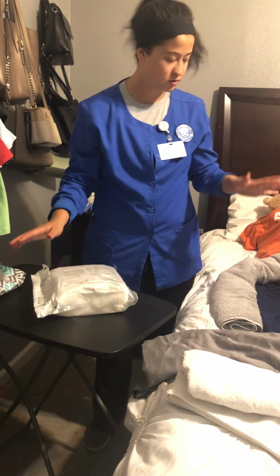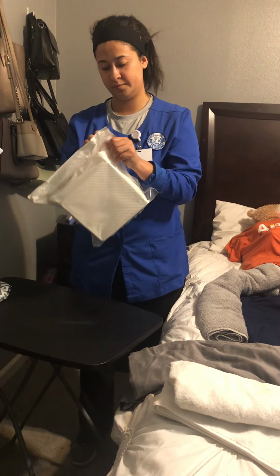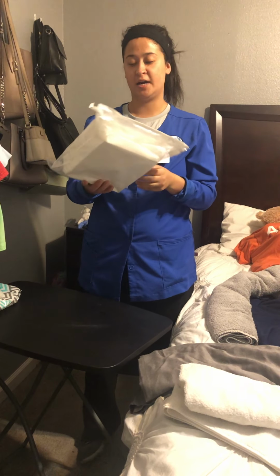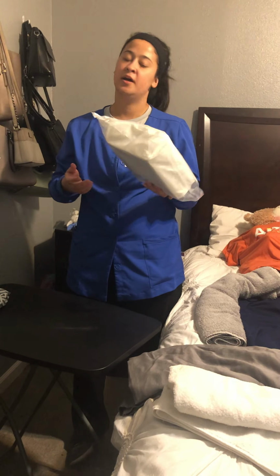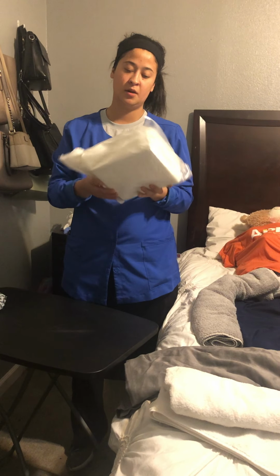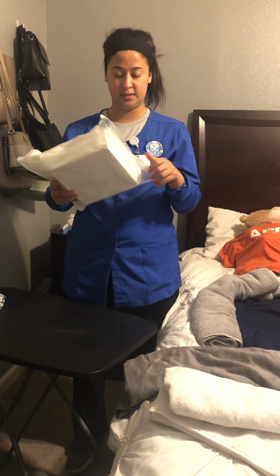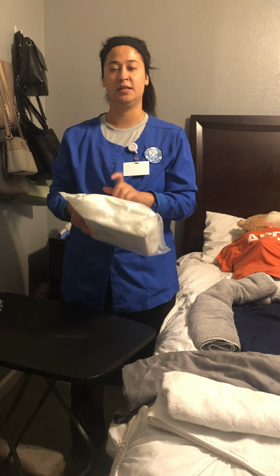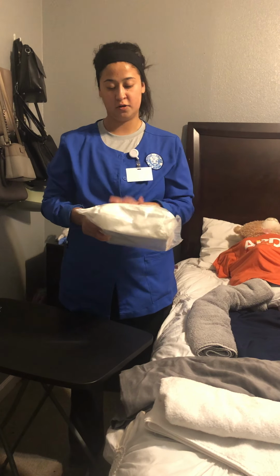My patient is comfortable still. I'm going to inspect my catheter kit, making sure it's not broken and that it's still sealed. I want to look for the expiration date, make sure that what the doctor ordered is what I have.